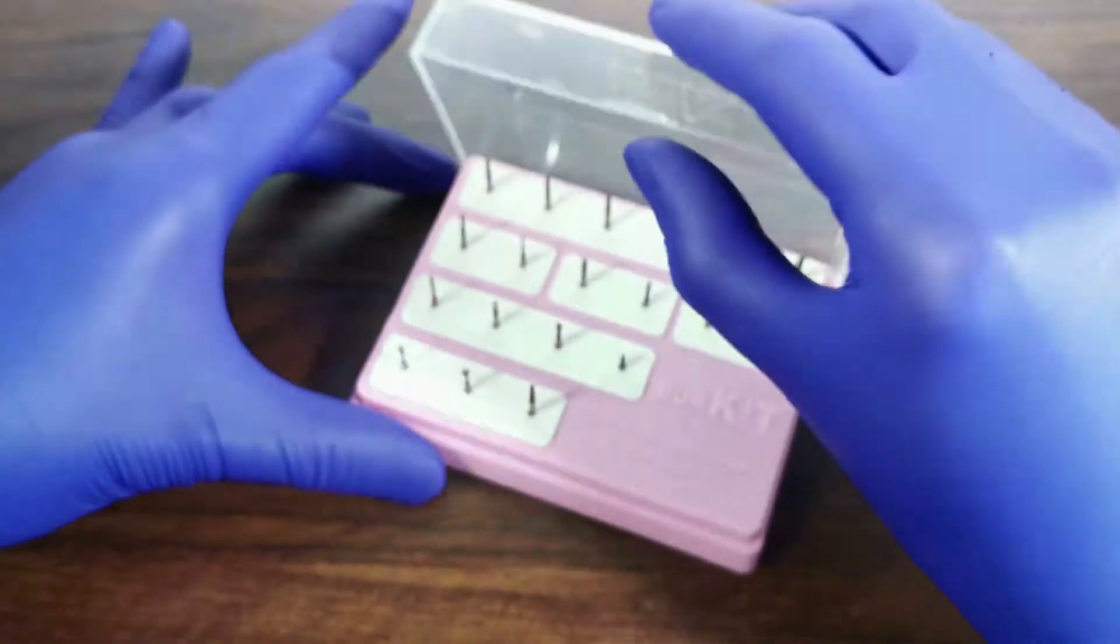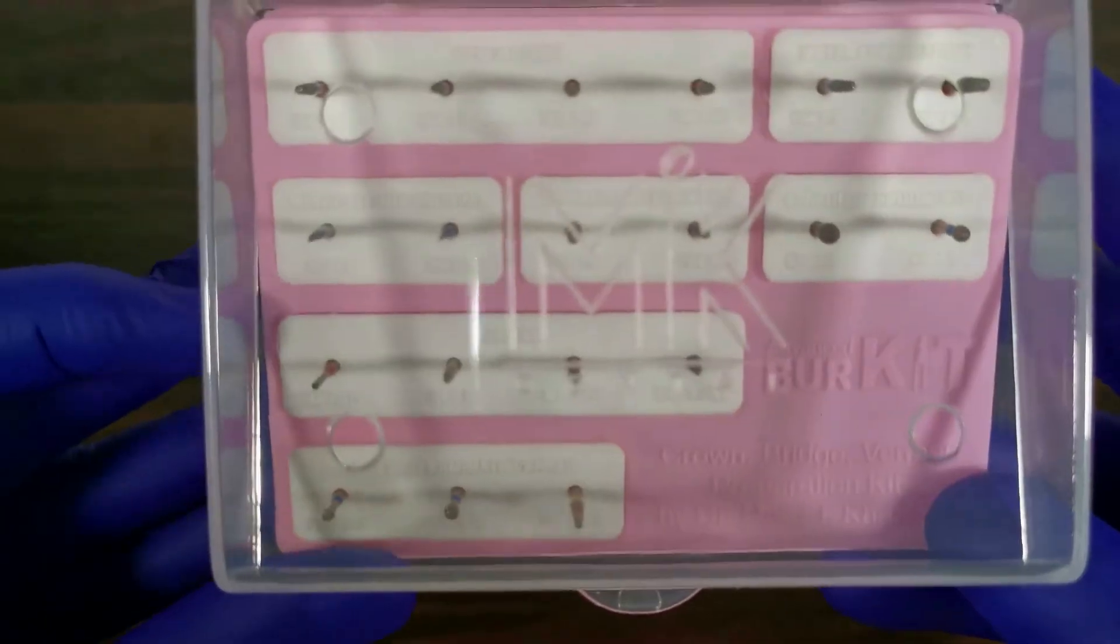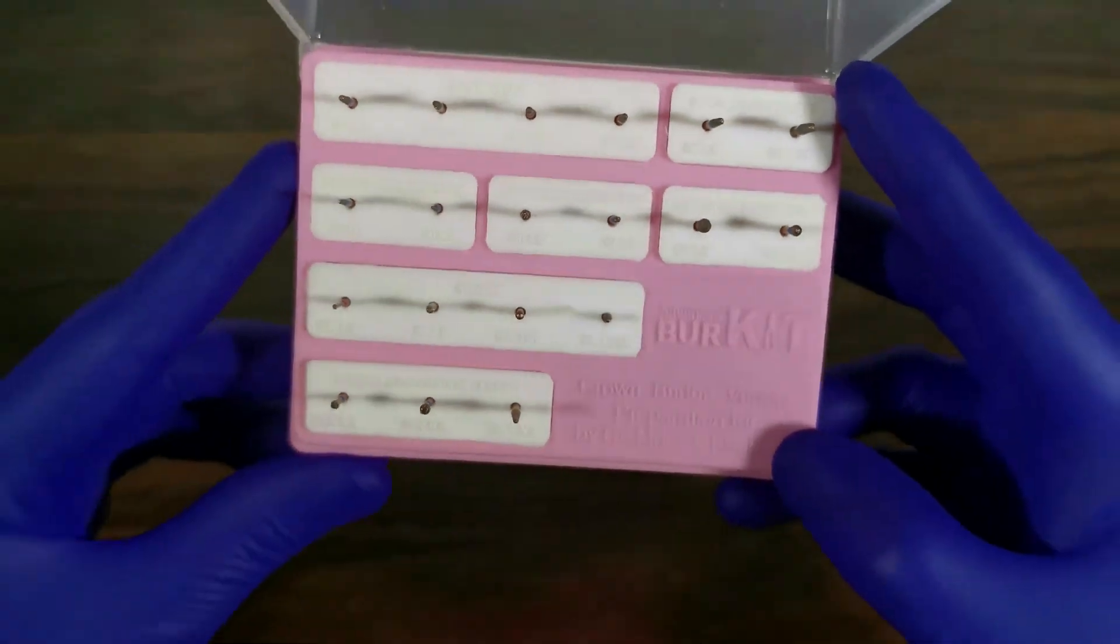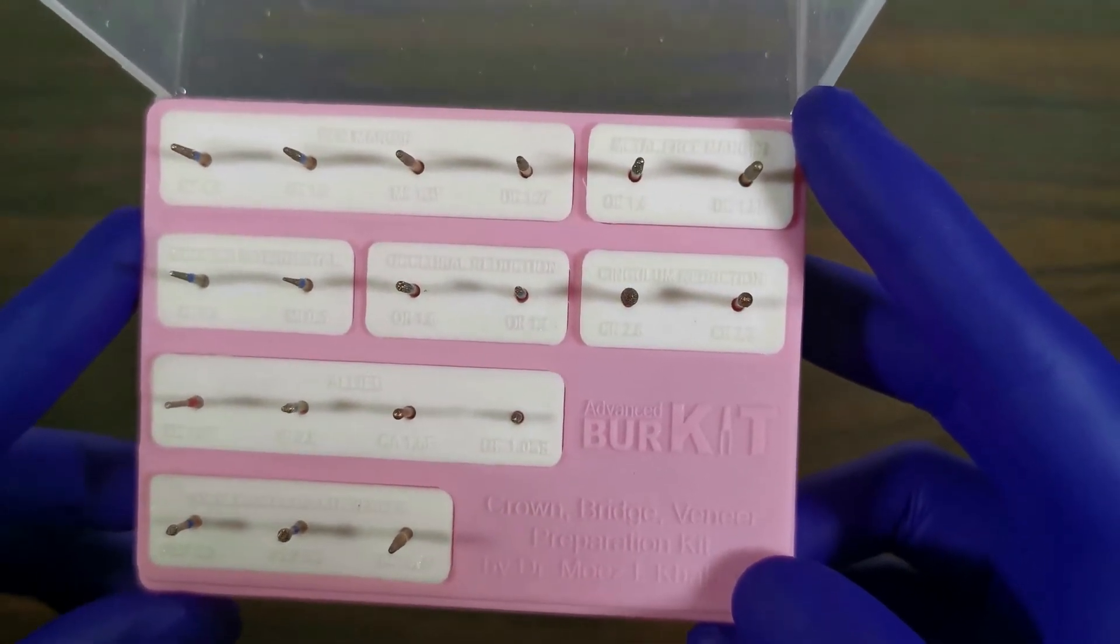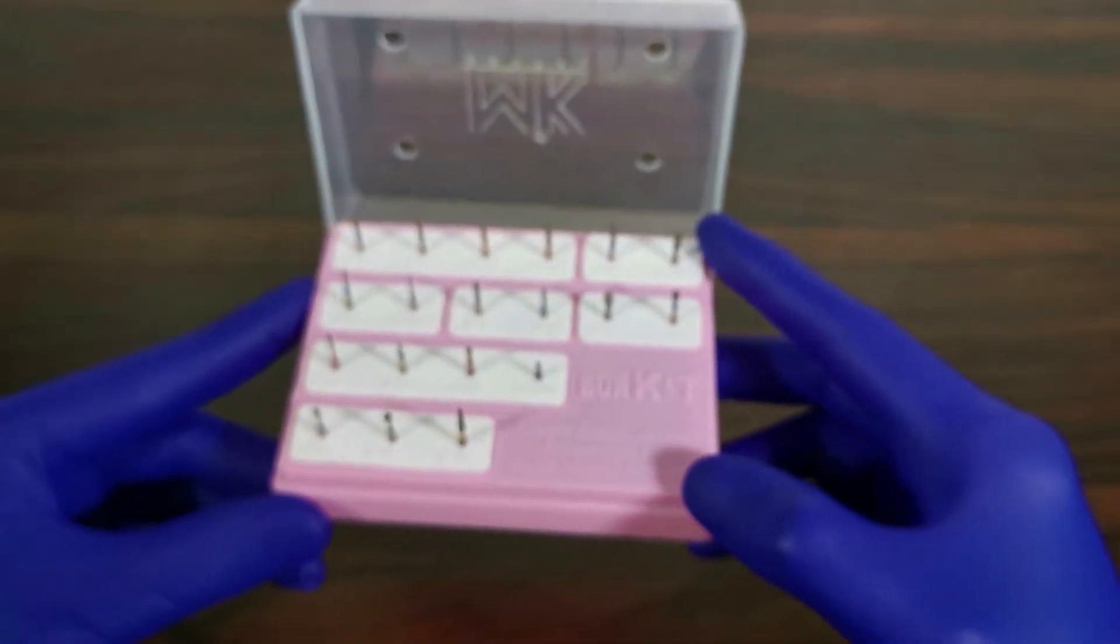In addition, the number associated with each burr indicates the diameter of the burr at its tip or its functional length. For example, DC 1.4 burr is a deep chamfer burr with tip diameter of 1.4 mm. IR 2.0 is an incisal reduction burr with a functional length of 2 mm.